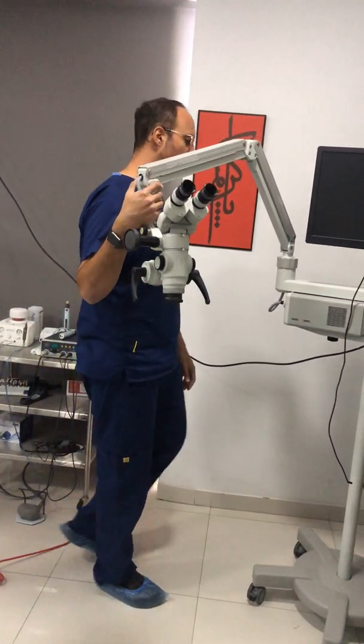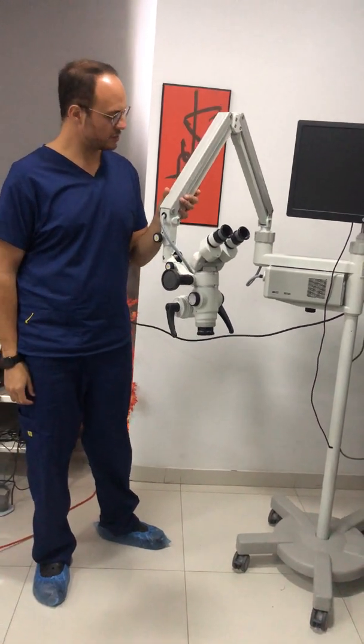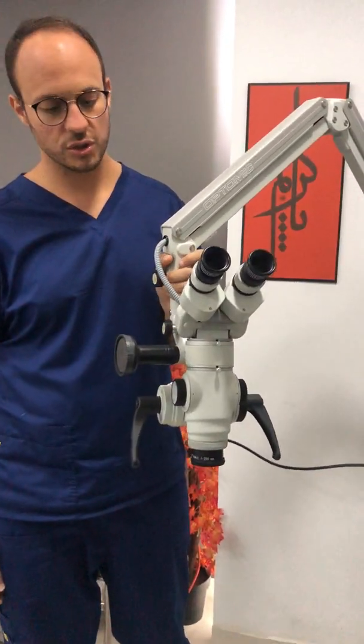Today I'll be reviewing some of the microscopes we have for testing in the clinic. I'll first start with the Optomic — a Spanish microscope company.